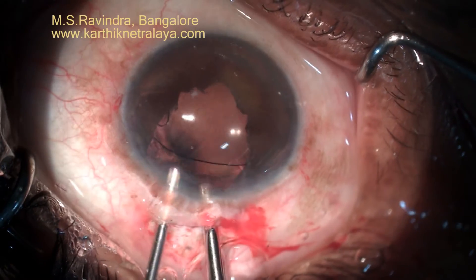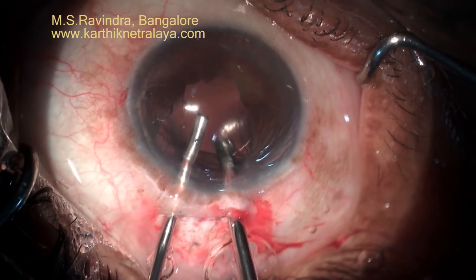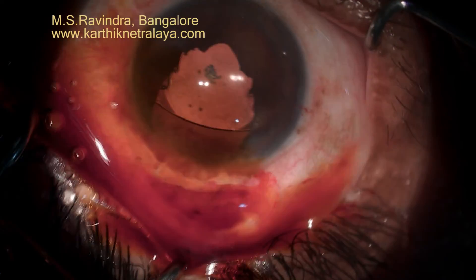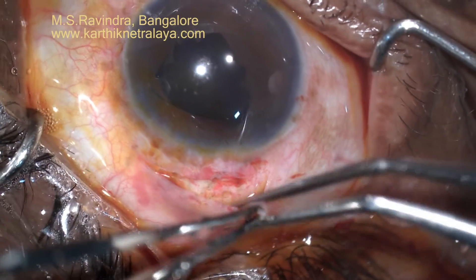Form the chamber and I still wanted to do some vitrectomy. You can infuse BSS through a cannula on your left hand and do a vitrectomy. It's a very easy, very simple, very elegant, very quick surgery.